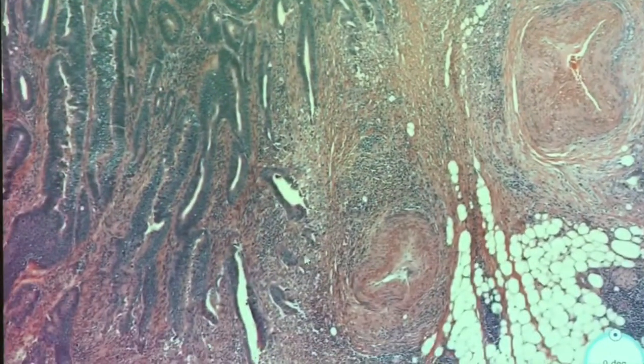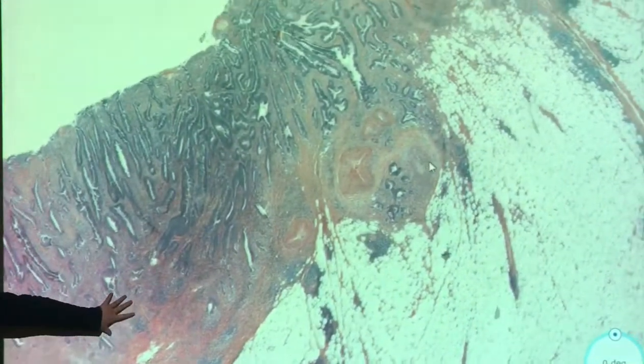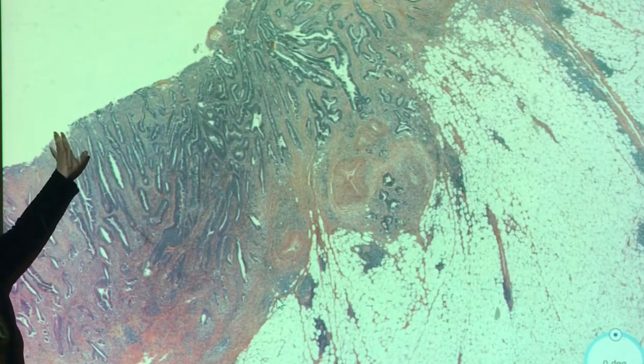I try really hard to give you a great section of things where I don't want you to guess too much. I mean, sometimes I do, but I try to limit the guessing. Where's the muscularis? It looks like it went completely through, like it just completely ate through it. Oh, here. It's gone. Yeah, so the cancer has eaten through it, because there's no real surface up here, right? Yeah, this is all ulcerated.